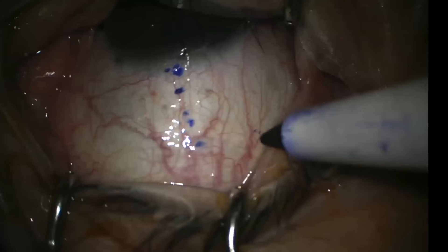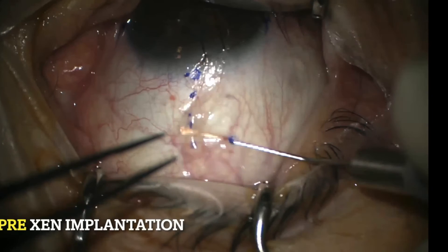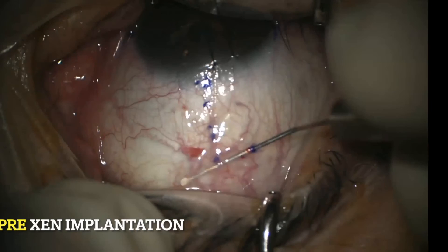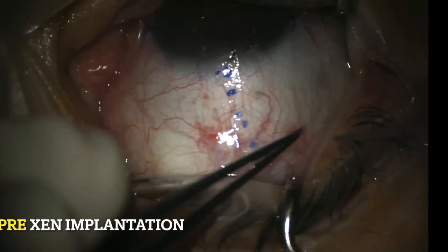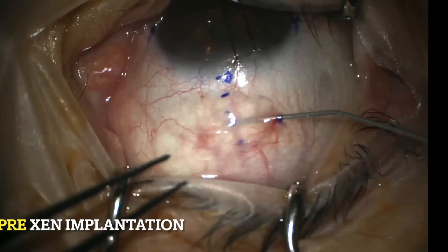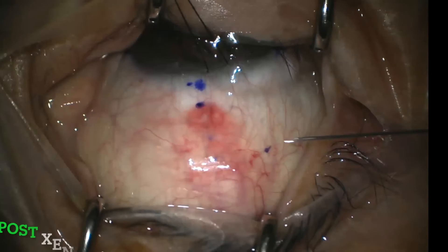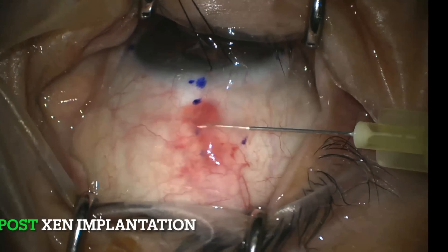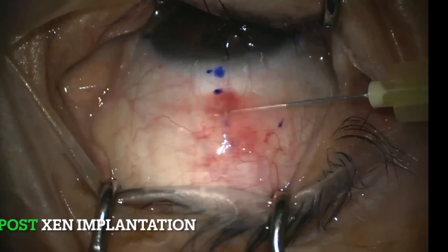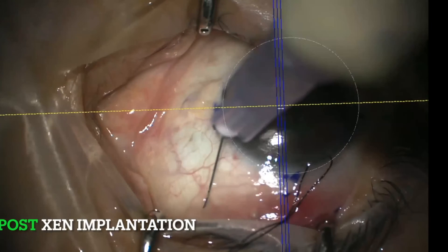Before XEN is implanted, I usually try to dissect conjunctiva from tenon's capsule using an iris spatula with a blunt tip. Some cases show strong adhesion between conjunctiva and tenon's capsule — if you inject mitomycin C in these eyes without dissection, it might not evenly spread in the subconjunctival space. Here, you can see the fluid wave of mitomycin C going very smoothly beneath the conjunctiva. After implantation, make sure the tenon's capsule does not stick around the stent. Carefully cut the surrounding tissue with a 30 or 34 gauge needle, ensure the stent moves freely in the subconjunctival space, and finally inject dexamethasone.